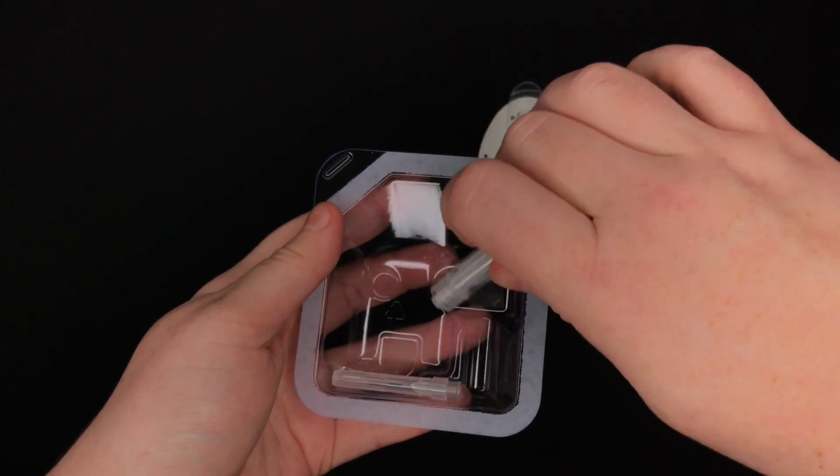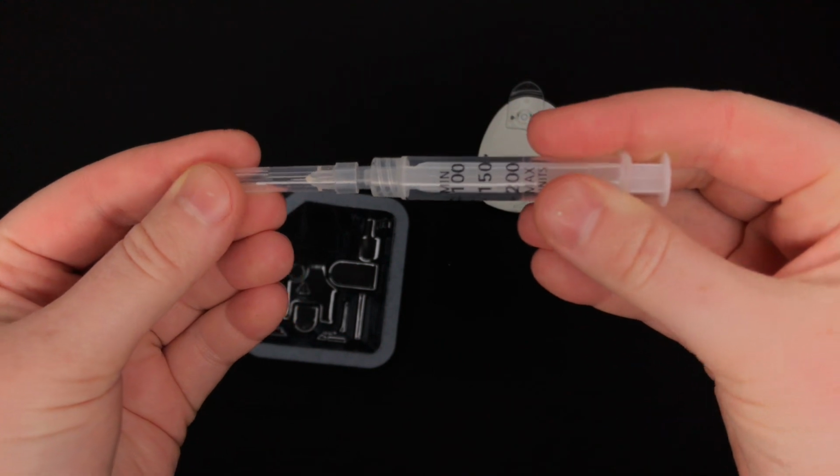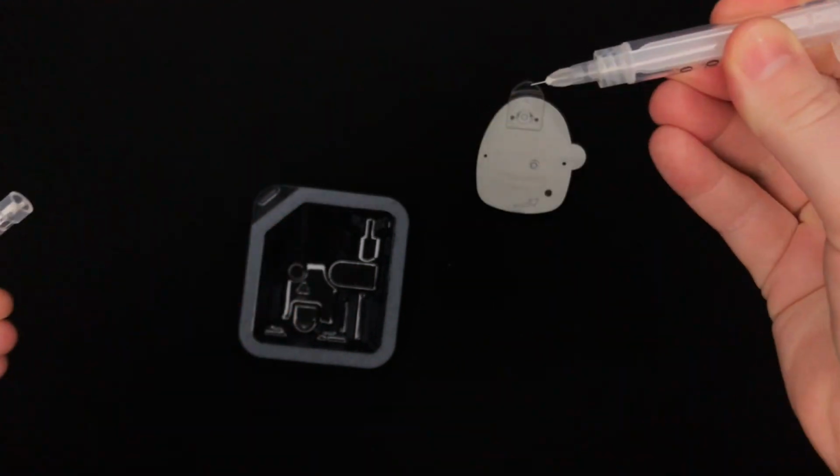Assembling the needle is actually quite easy. Just take the needle and the plunger and push them together and twist. And voila, you have a working needle.